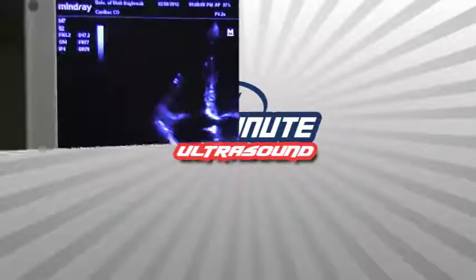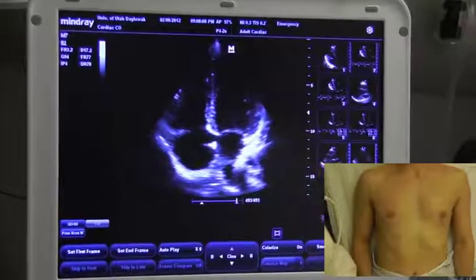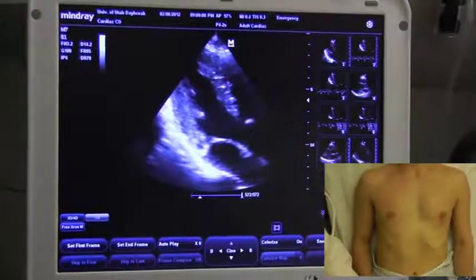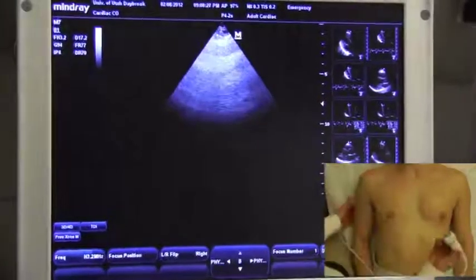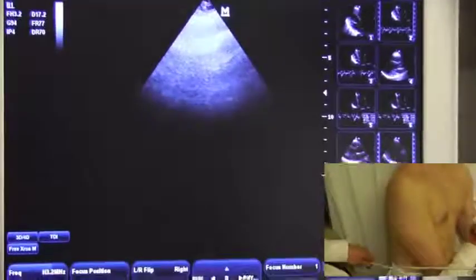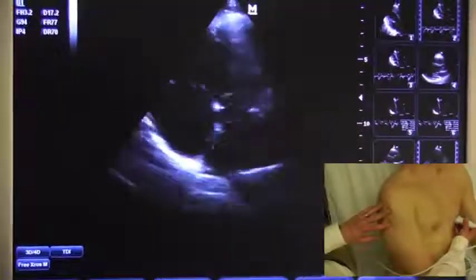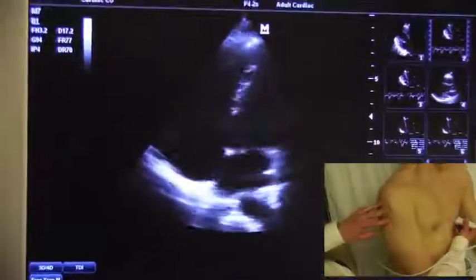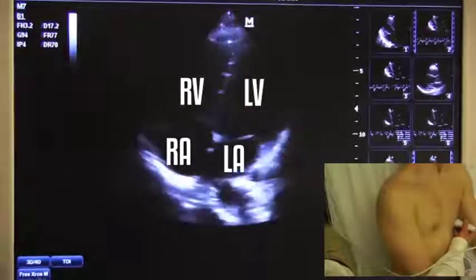One minute ultrasound for diastolic function. We'll need the apical four-chamber window, so I'll place the patient in the left lateral decubitus position. The probe will be at the patient's PMI, with the marker pointed towards the patient's axilla, or towards the bed. This gives me the apical four-chamber window.